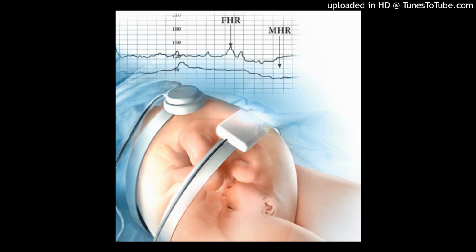For example, if the FHR is within normal limits but has changed significantly from the previous assessment, a longer listening period or more frequent assessments may clarify whether the rate is a change in baseline or a temporary increase or decrease. Counting is done between contractions and when the fetus is not actively moving. Clinicians should palpate a maternal radial pulse simultaneously to distinguish between maternal heart rate and FHR during auscultation. Rhythm should be noted as regular or irregular.